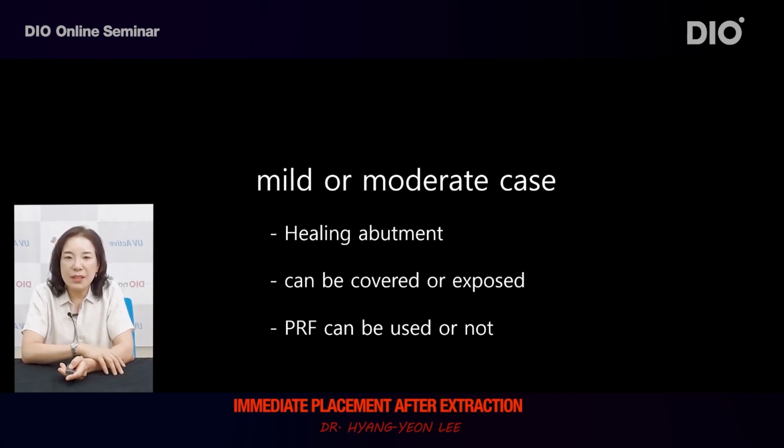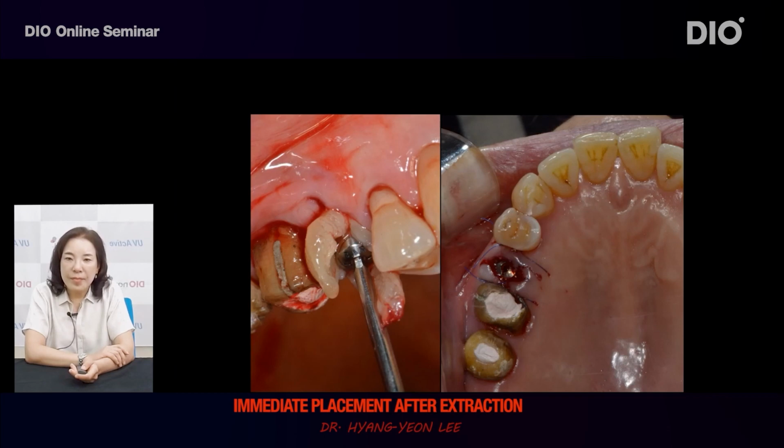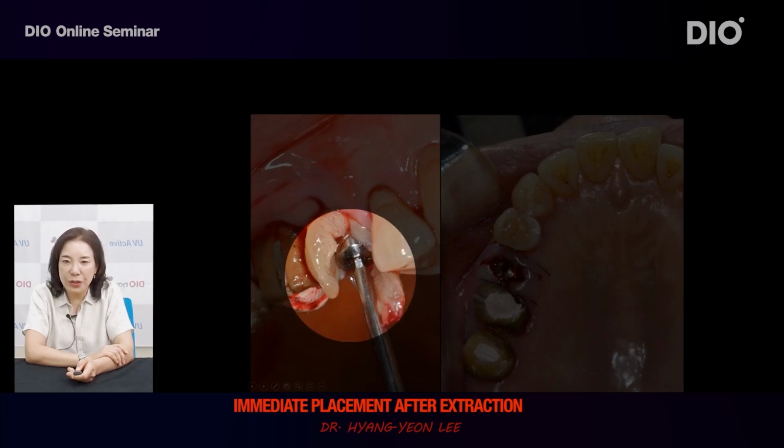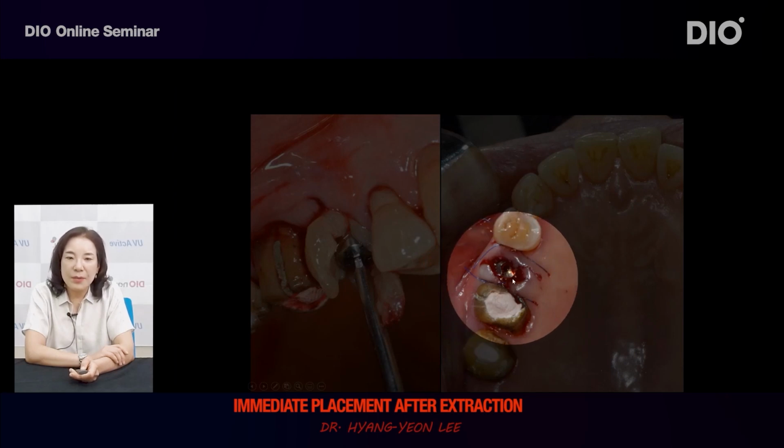Although healing abutment is used in the majority of mild or moderate cases, healing abutment could be completely covered and can also be exposed. There also are cases in which PRF can be used and need not be used. If the tooth extraction socket is small like this, it is all right not to use PRF. You can use healing abutment or leave it exposed. In addition, if the tooth extraction socket is deep, you can put the healing abutment to the extent of being placed slightly inside.